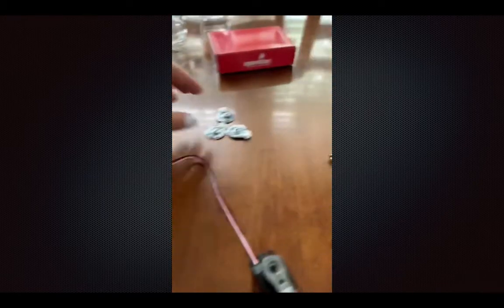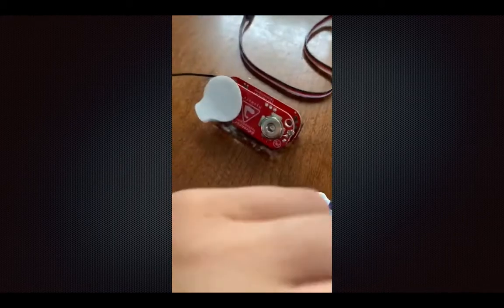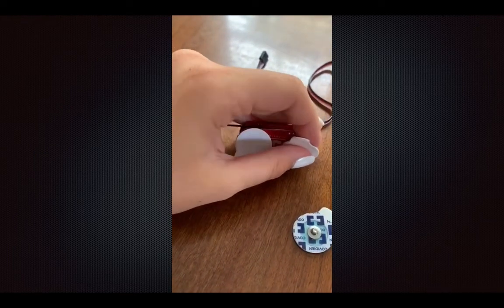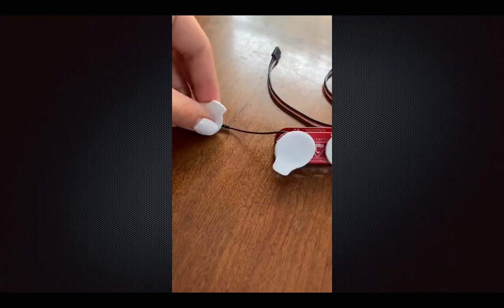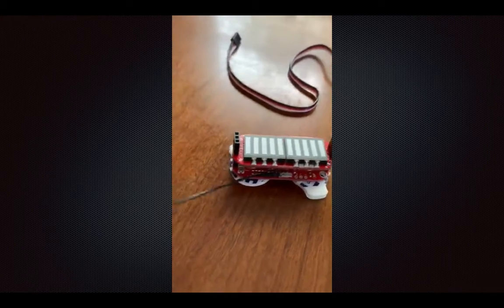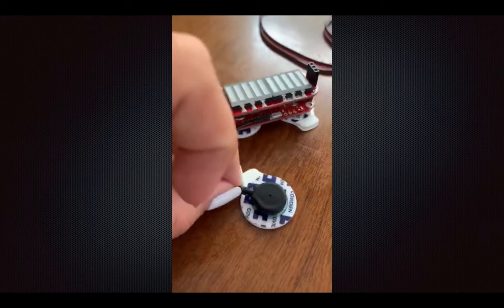Next, we're gonna attach these electrodes to the MyoWare sensor, and then we're gonna stick it to a muscle. This part has to go in the middle of the muscle, this side, and then this side has to go to the end of the muscle, and this is just really an extra support that goes on the side of the muscle.